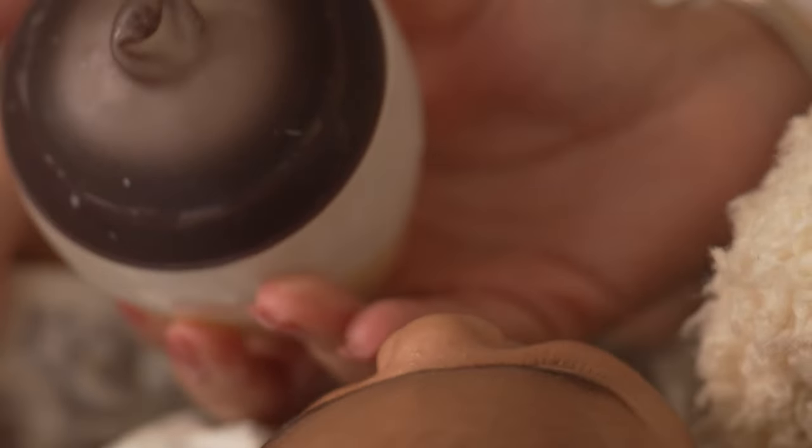You may notice the nipple compressing during feeding. This is normal and it's due to the suction from the baby's latch. Feed confidently knowing that this does not affect the flow of milk.